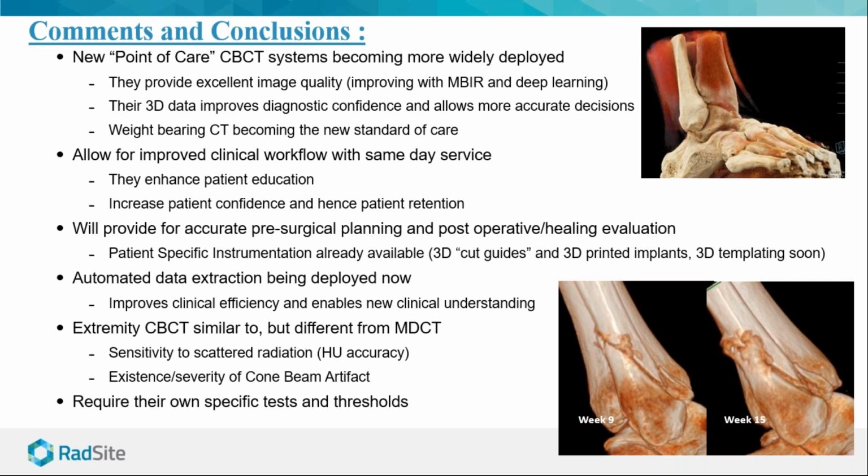They provide excellent image quality, which will get better as model-based iterative reconstruction and deep learning reconstruction approaches are introduced into the market. And their 3D data can improve diagnostic confidence and allow more accurate decisions. And weight-bearing CT is slowly becoming the new standard of care in some areas of orthopedic practice.